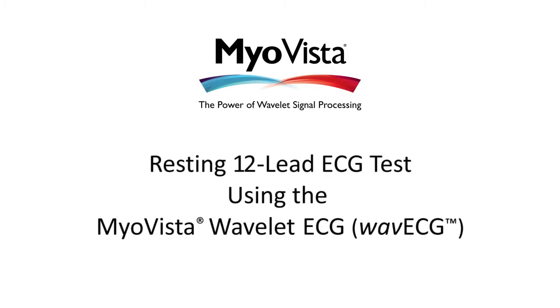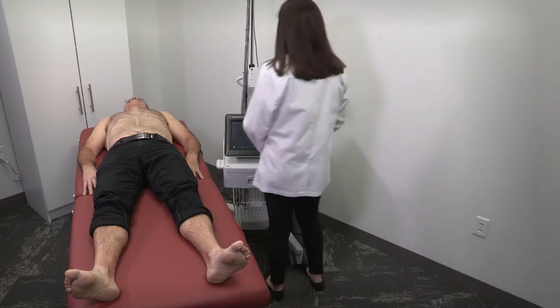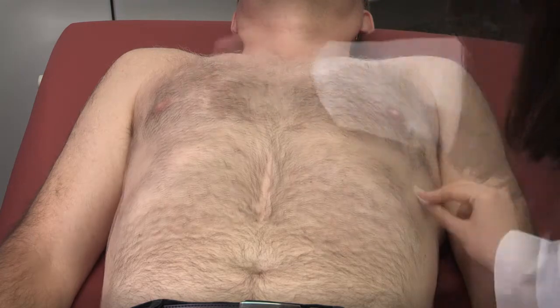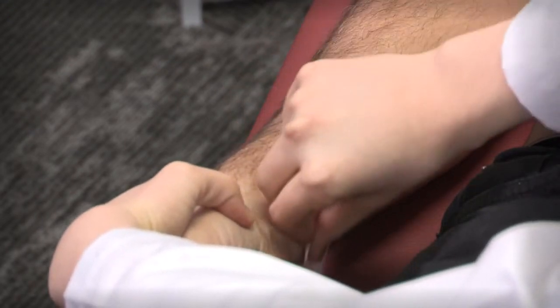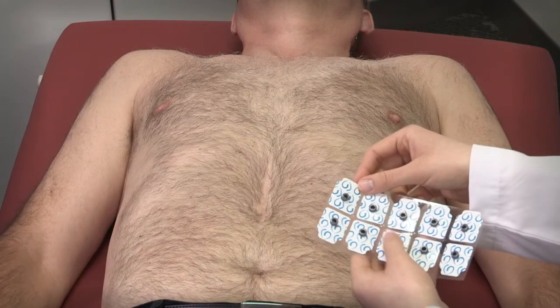The following demonstrates conducting a MyoVista Wavelet ECG test from start to finish. Ensure your patient is lying flat in a relaxed position. Using a skin prep wipe, clean the areas where the electrodes will be positioned. Perform any other prep necessary for optimal connection. Be sure to prep the skin for the precordial leads and the limb leads.